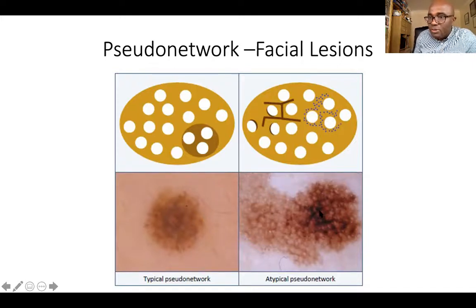Again, dermoscopy helps the histologist by showing where you're going to take the biopsy from. Sometimes you can have a very large solar lentigo on the face of the patient, and when it comes to seeing them in a 2-week wait clinic, they want to confirm that these dark areas are melanocytic changes suggestive of melanoma. Therefore, you can concentrate on the area and do a punch biopsy before the plastics team, or mostly MaxFax, arrange whether they need further treatment, wide local excision or other forms of treatment for melanomas on the face.